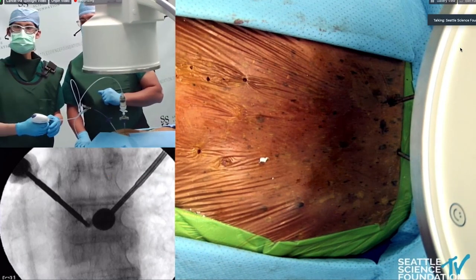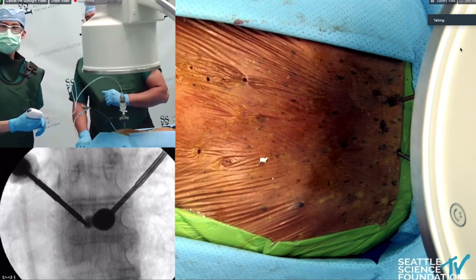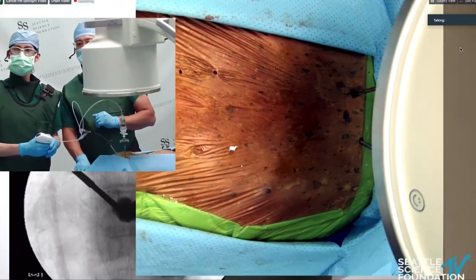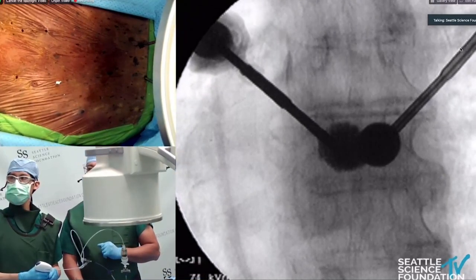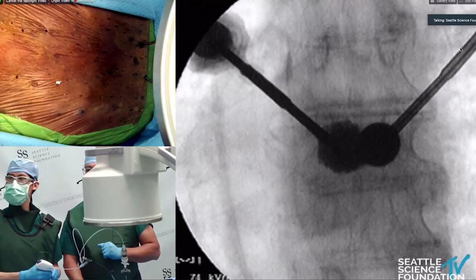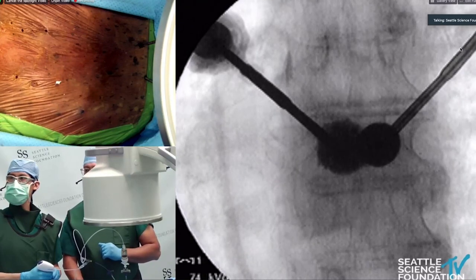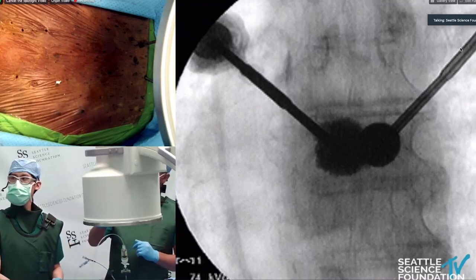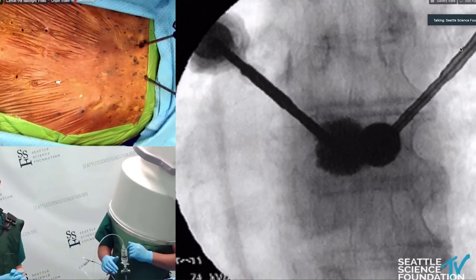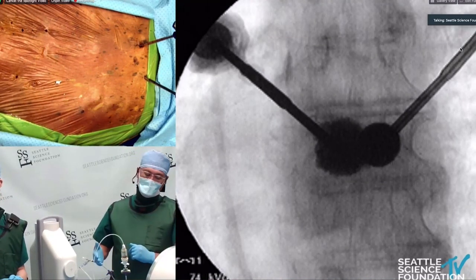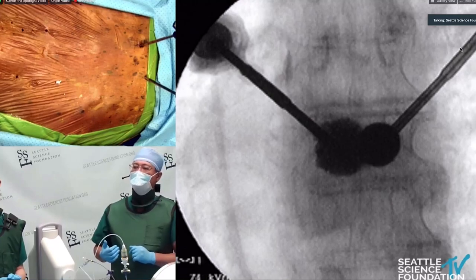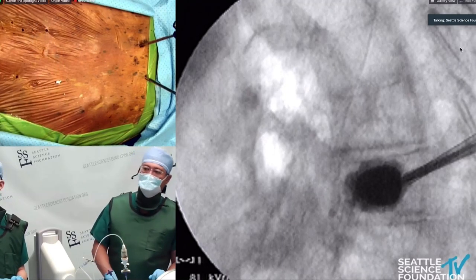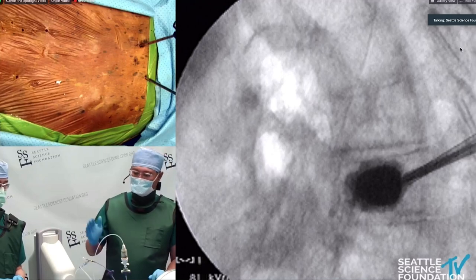Let's go live and deliver cement. We can see a good spread of the cement. We leave the opposite balloon inflated while filling one side so as to provide support — especially for collapsed vertebral bodies. We want to check under lateral view as well, which is the most important view, making sure that the cement isn't going back towards the spinal canal. Looks like a good spread of the cement, but again we need to make sure that's confirmed under lateral view.